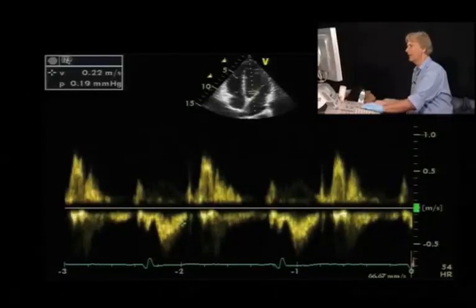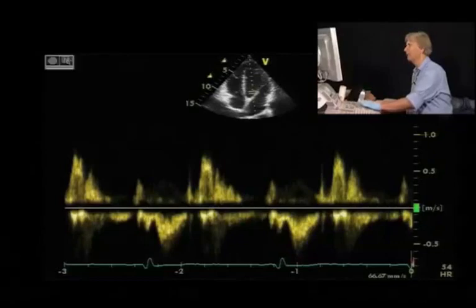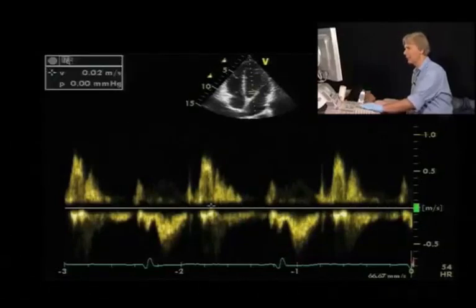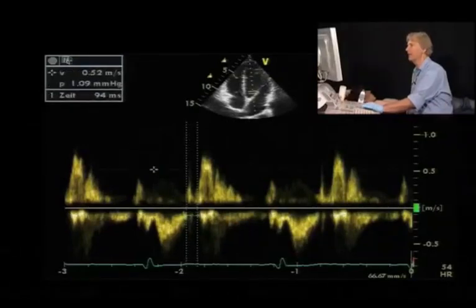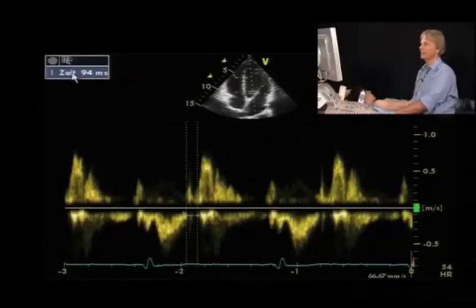You have the aortic outflow signal here, and the beginning at least of the mitral inflow signal. The duration between these two signals is the so-called isovolumetric relaxation time. So the end here to the beginning right here would be the isovolumetric relaxation time.